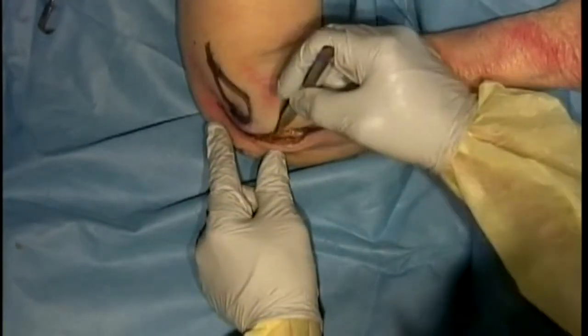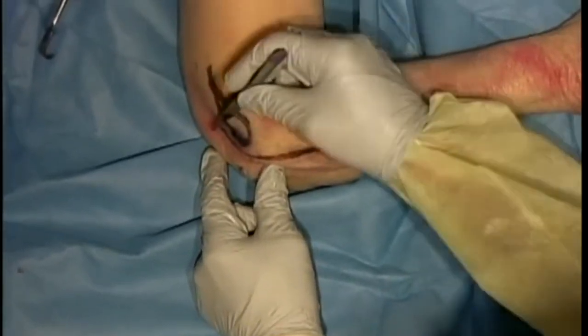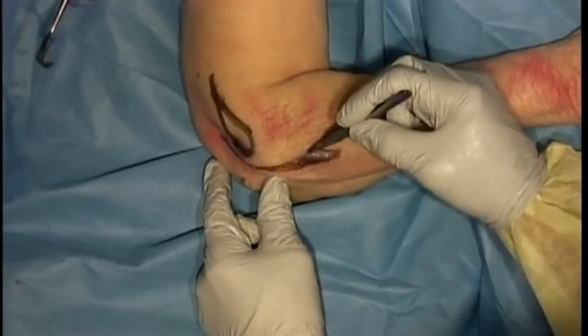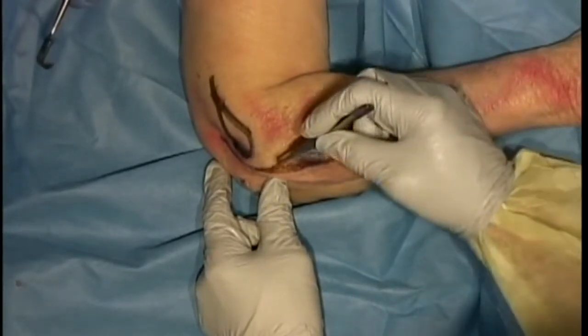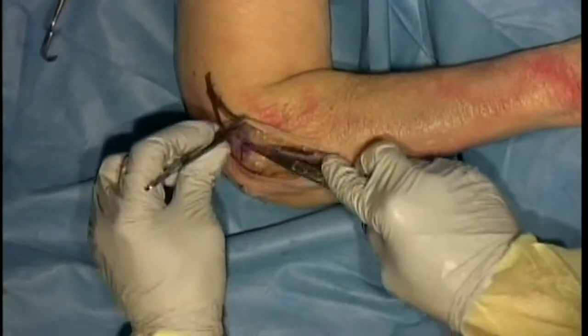And then you're going to make your skin incision. I tend to make it curved. Some people might be more straight, but a curve tends to work fairly well. There's not a lot of nerve branches here distally to worry about, unlike on the medial side. So it's pretty much make your incision and just develop your planes down to your fascia.